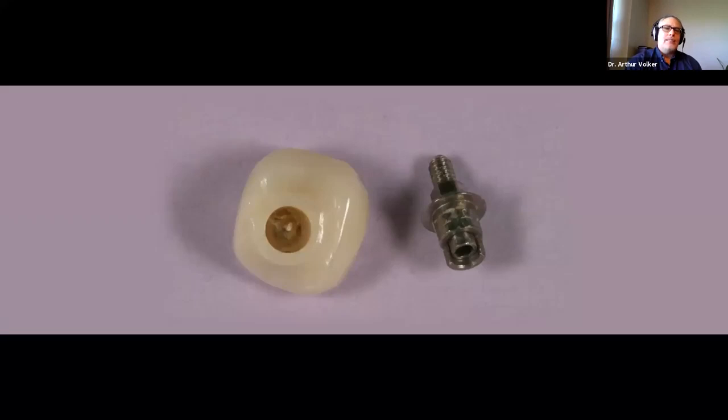Patient gives you a call and they say, "Doc, I think my implant broke." And there's nothing better to hear on a Monday morning than, "Doc, I think my implant broke." And you go in and take a look and you're like, "Oh my gosh, what is that?" And you unscrew it and you see, obviously, all that really happened was that the zirconia crown separated from the tie base. This is almost like a stock abutment that you can use.